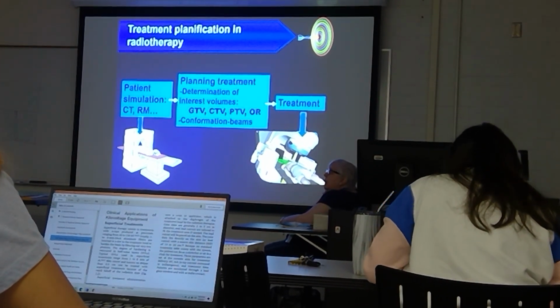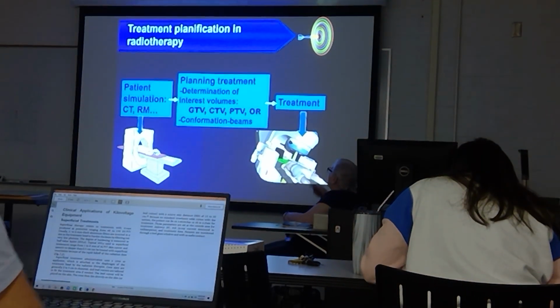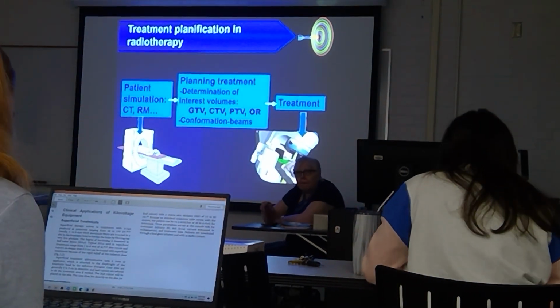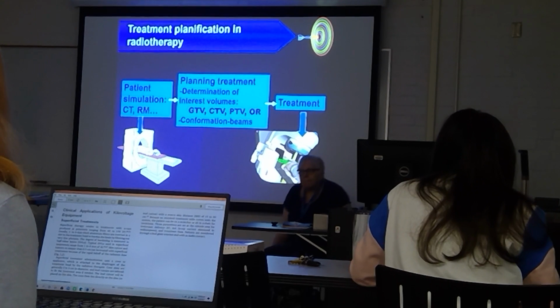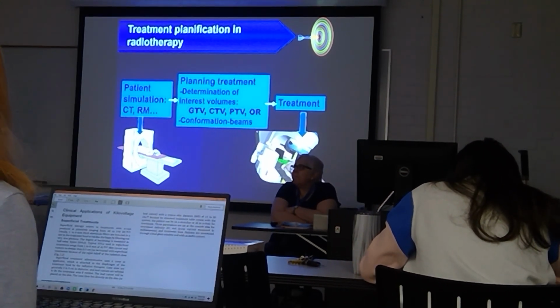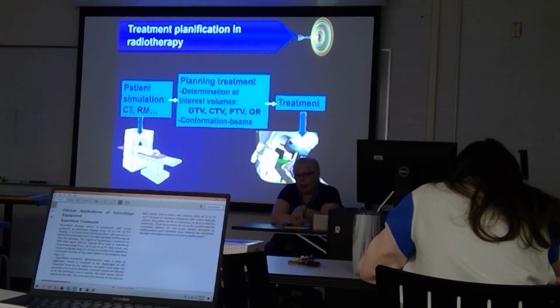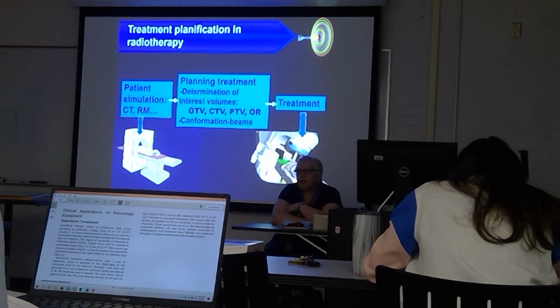What equipment can be used to do IGRT? KV imager. How are you going to use the KV imager to do IGRT?